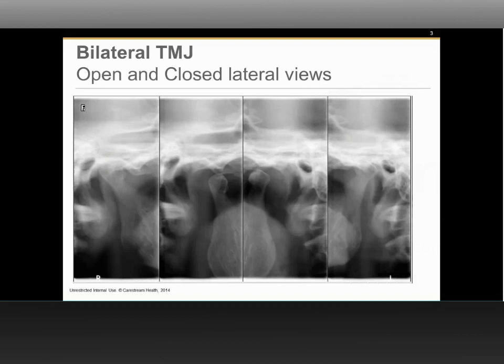So you're emphasizing that it's the third dimension that's critical, and that's what's missing from the 2D radiographs. I think you have nailed the point. That is exactly what it is. It is the third dimension, as I've mentioned earlier in our previous discussions. A 2D image is nothing but a two-dimensional representation of a three-dimensional structure.